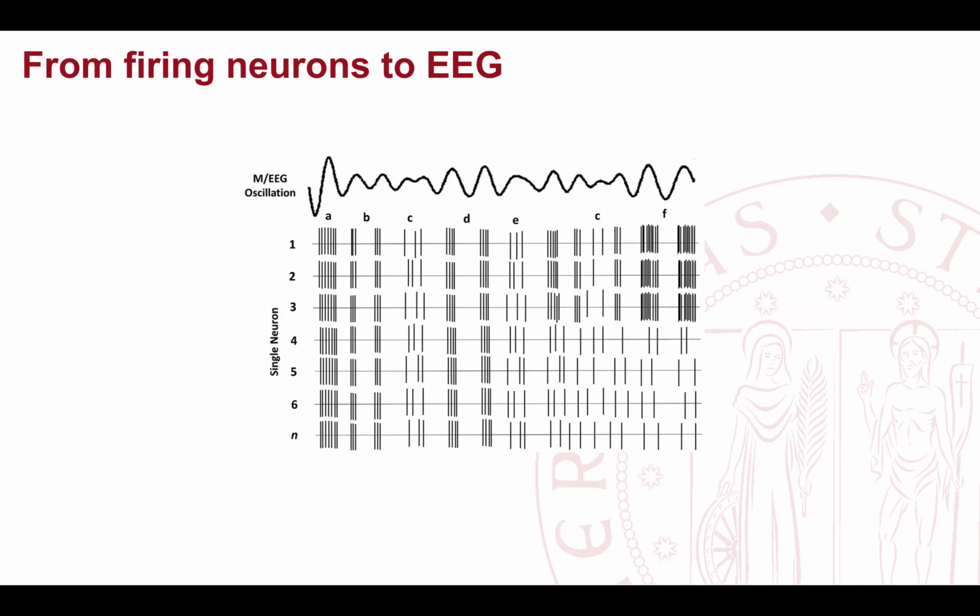If we imagine having several neurons within our brain, all of them communicating through spikes, what we really see is basically the convolution, the union, of the activity of all these neurons, collected by the single EEG electrodes. So our EEG oscillations come from the combined potentials generated by different neurons within our brain. Nevertheless, this can still be very informative.